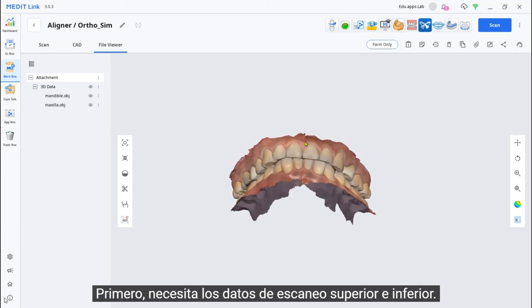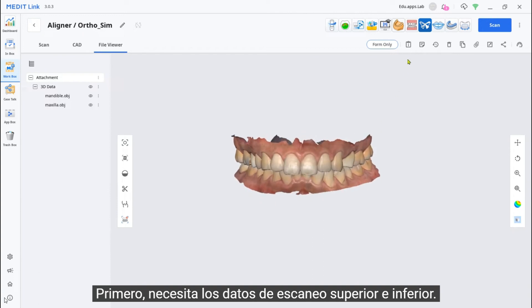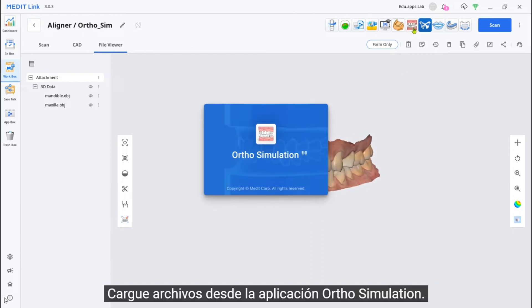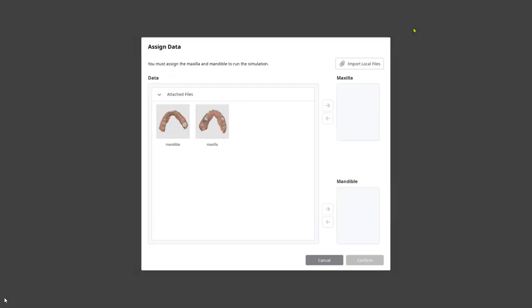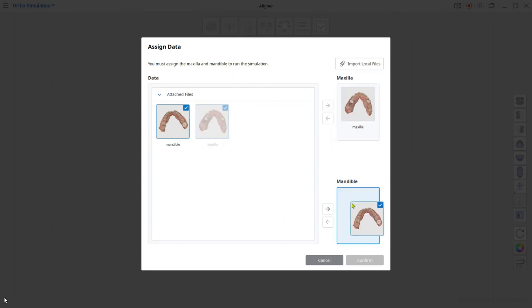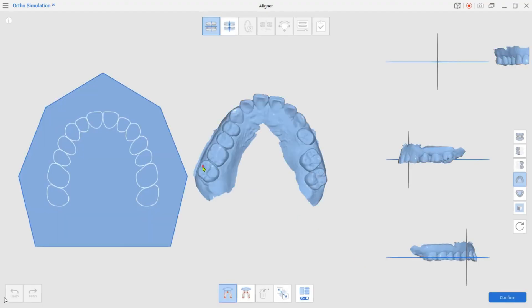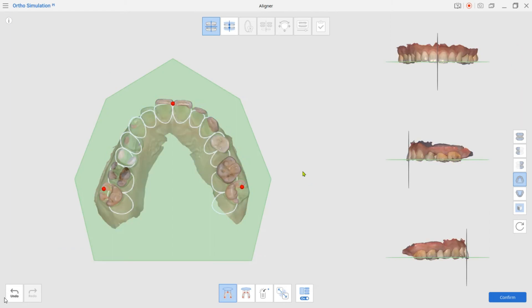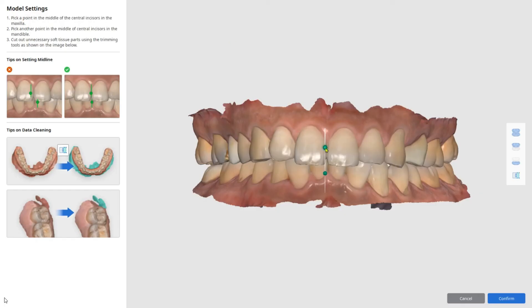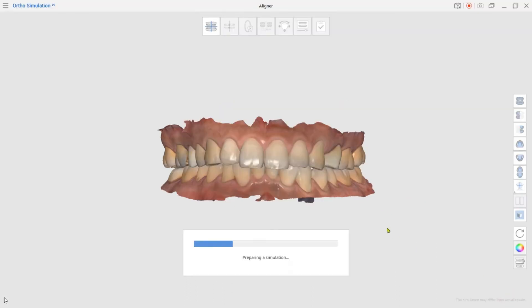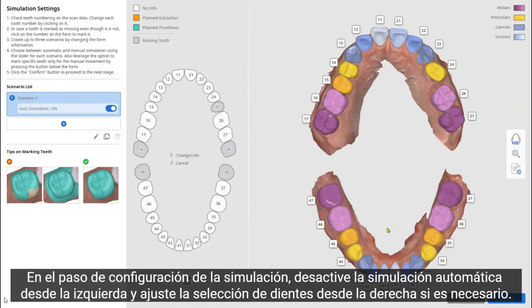First, you need the upper and lower scan data. Load files from the OrthoSimulation app. At the Simulation Settings step, deactivate the AutoSimulation from the left and adjust the Teeth Selection from the right if needed.